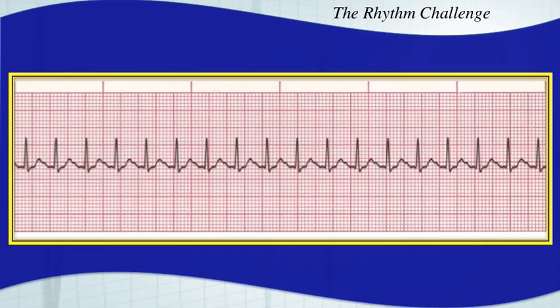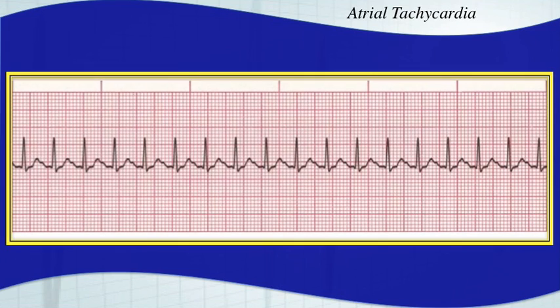This is an atrial tachycardia. You do have P waves — they're hidden in that T wave that looks like it has a little bit of a bump. T waves never have bumps like that; it's always caused by something like a P wave hidden in there.